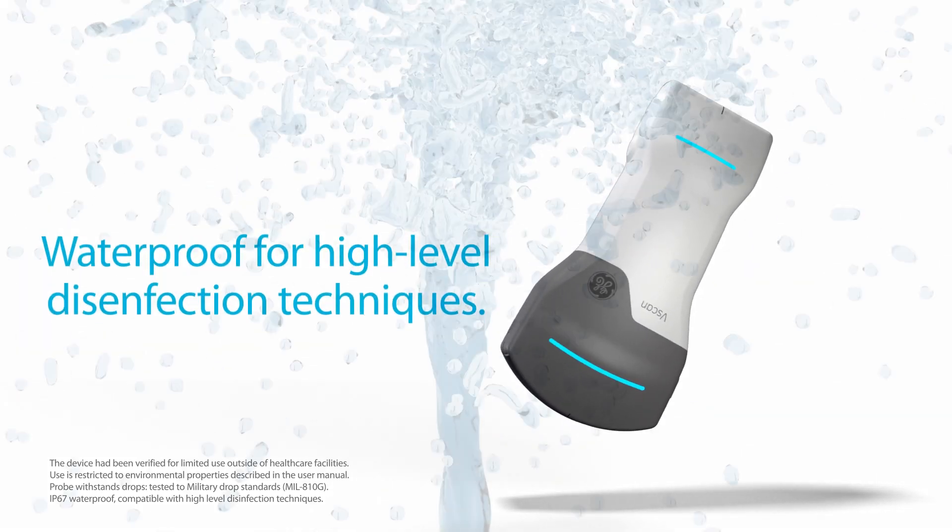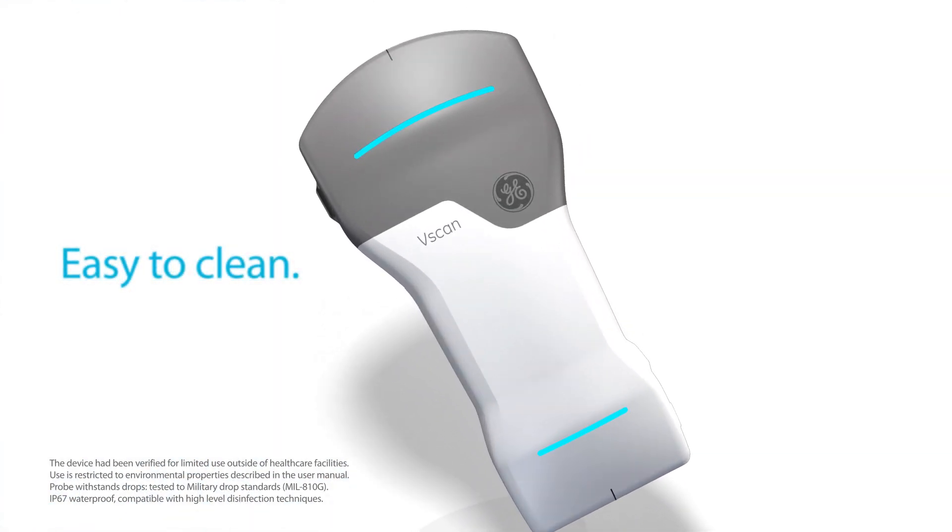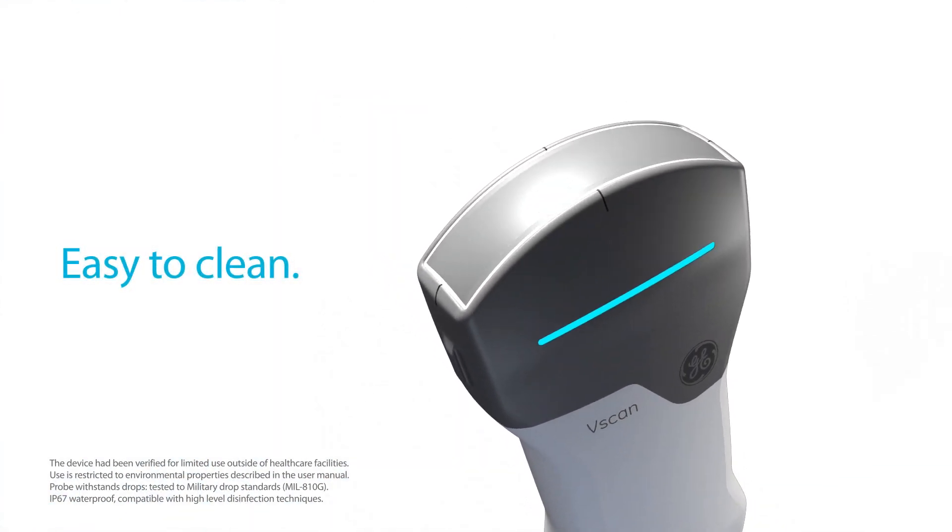Waterproof for high-level disinfection techniques, vScan Air's smooth and rounded design presents limited cracks to collect dirt or germs, making it easy to clean.